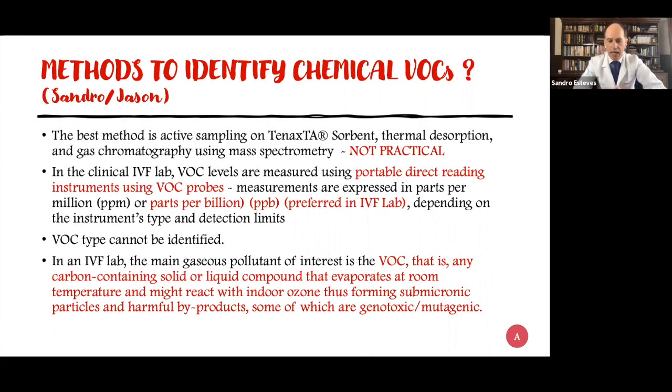Sometimes it's very hard to construct labs with air handling units, as we have presented. Then installation of these portable units inside the lab could be useful, provided you actually check the quality of air you are taking. Then you need to do some VOC measurements and eventually the particle count as well, to see if you are achieving at least the minimum standards.